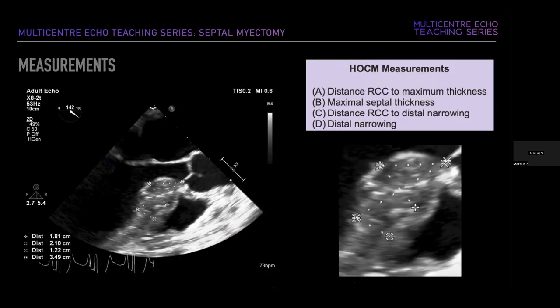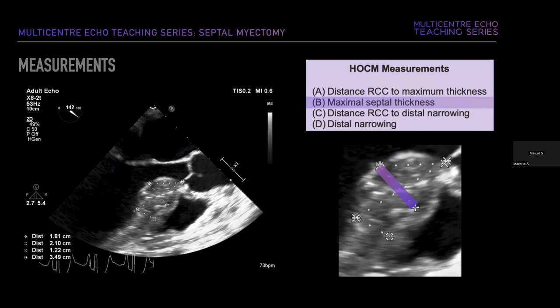The TEE for septal myectomy starts by accurately defining the borders of the intraventricular septum. This relies on four principal measurements: the distance from the right coronary cusp to the maximal septal thickness; the maximal septal thickness itself — a clinical diagnosis of HOCM requires a maximal wall thickness over 15 millimeters in adults in the absence of another cause; the distance from the right coronary cusp to the distal narrowing; and the distal narrowing itself.